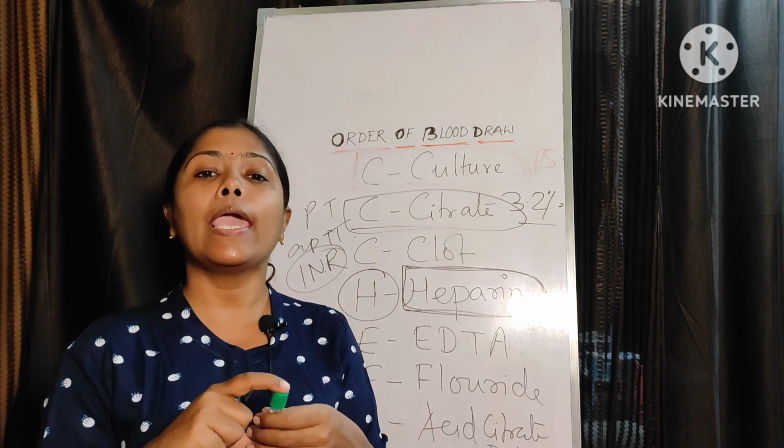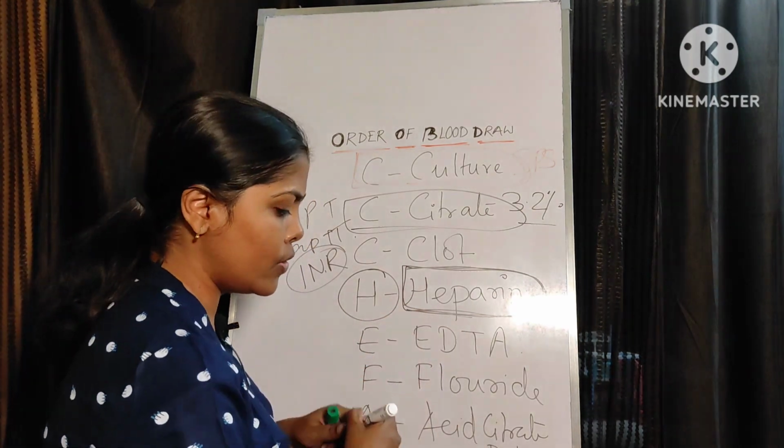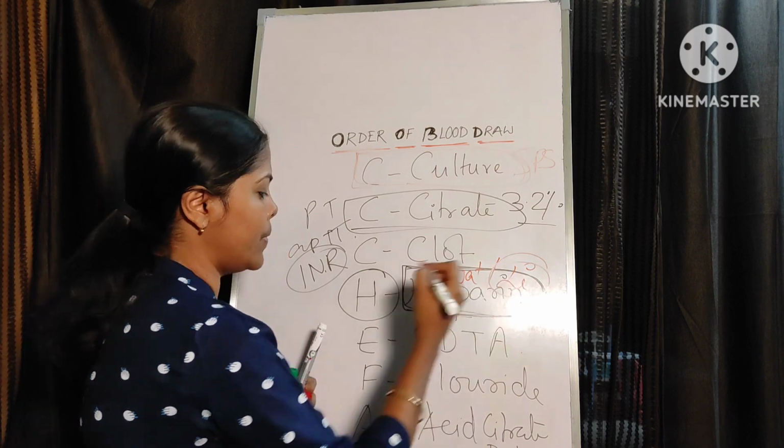We use this heparinized vial. Two types of salts I have already mentioned for the heparin vial: one is sodium heparin, another one is lithium heparin.